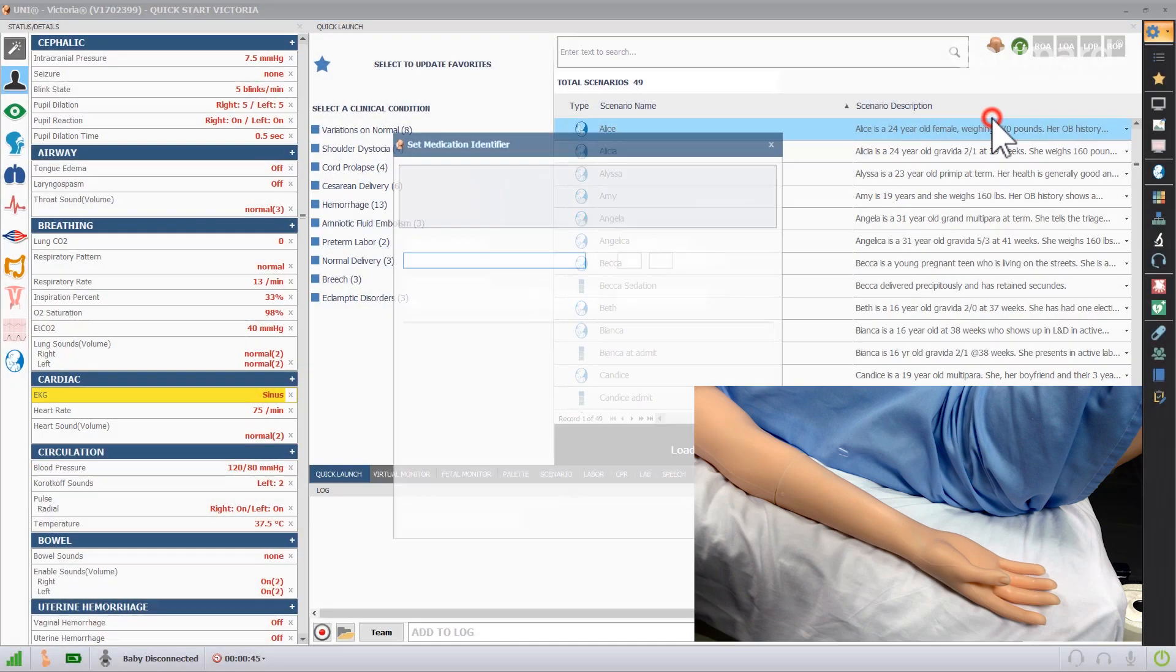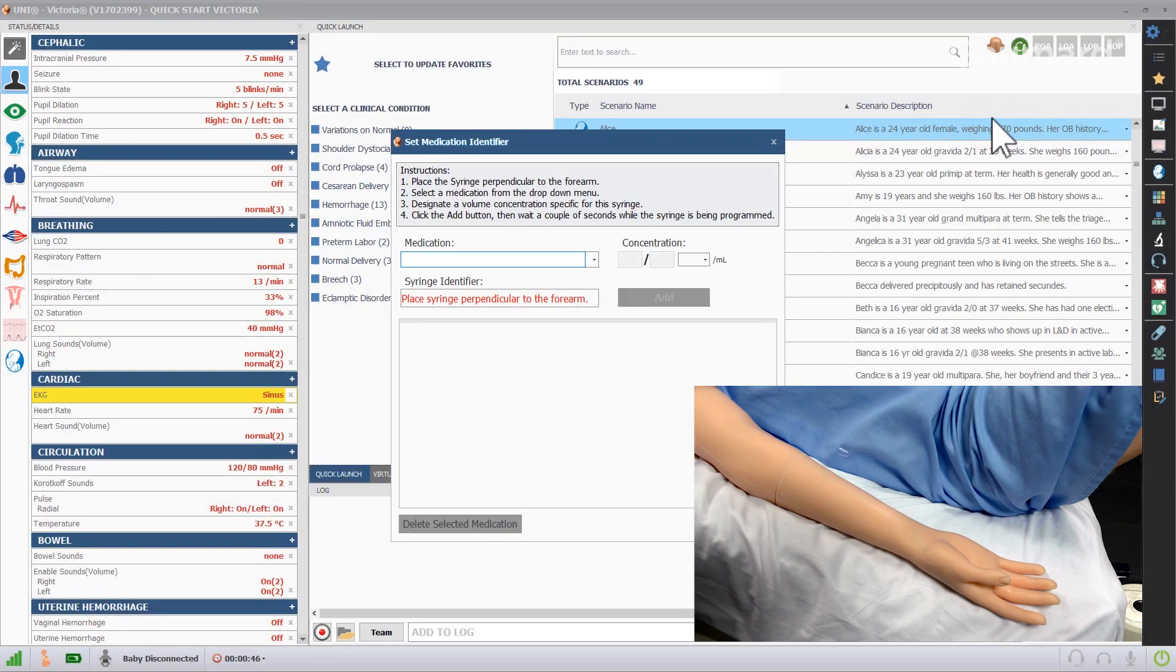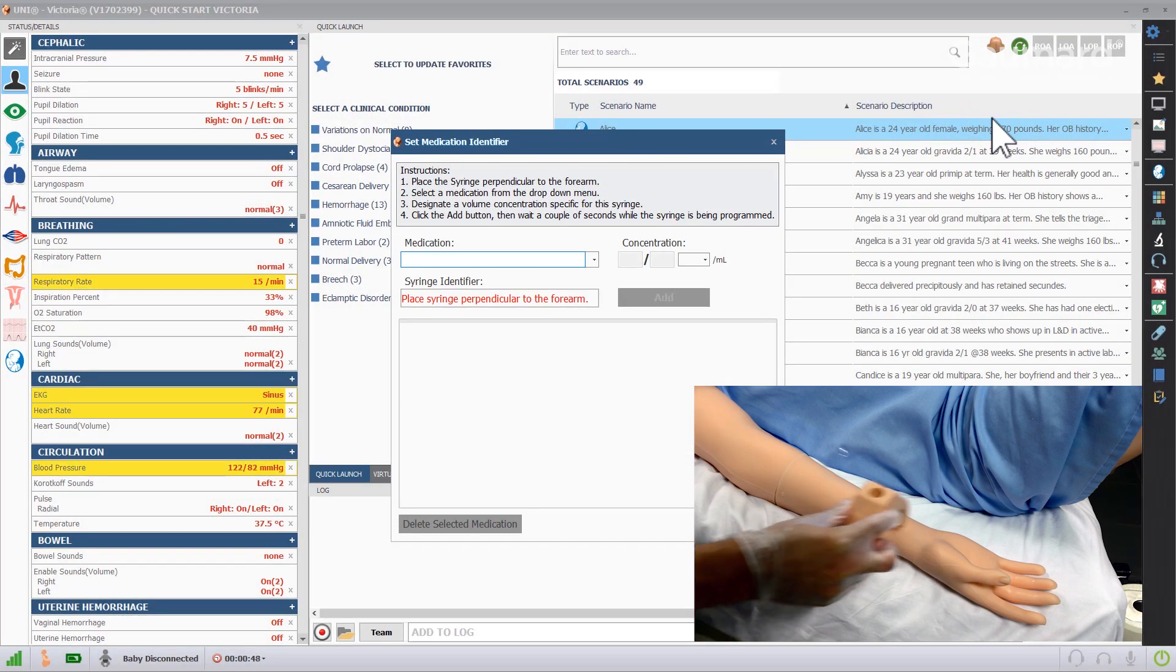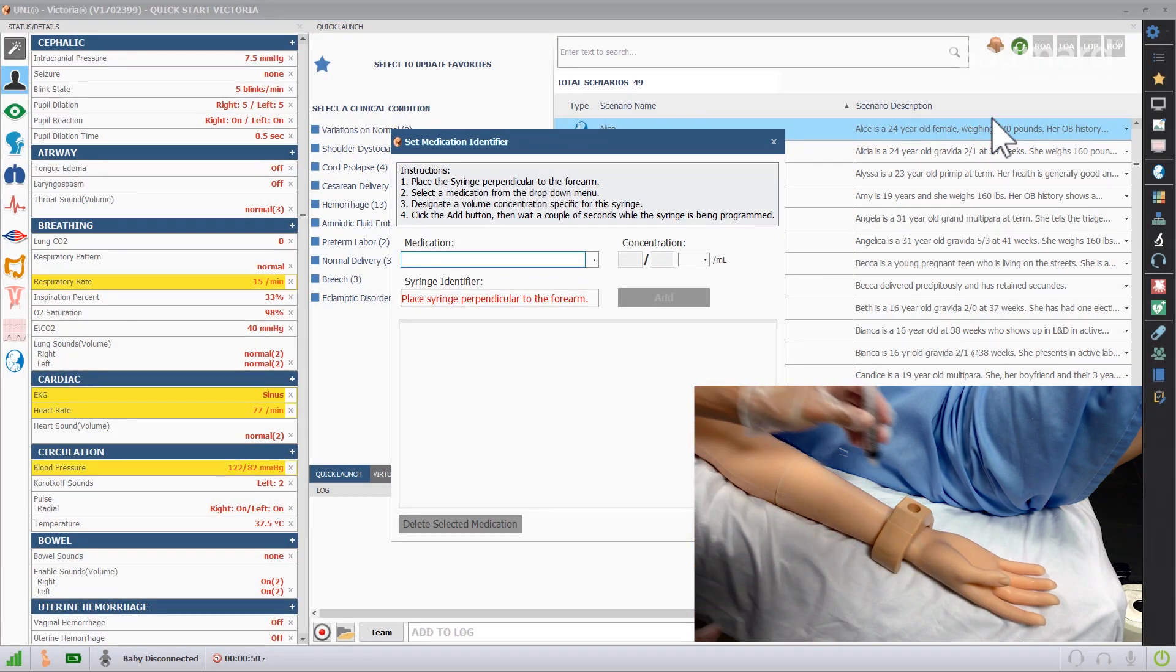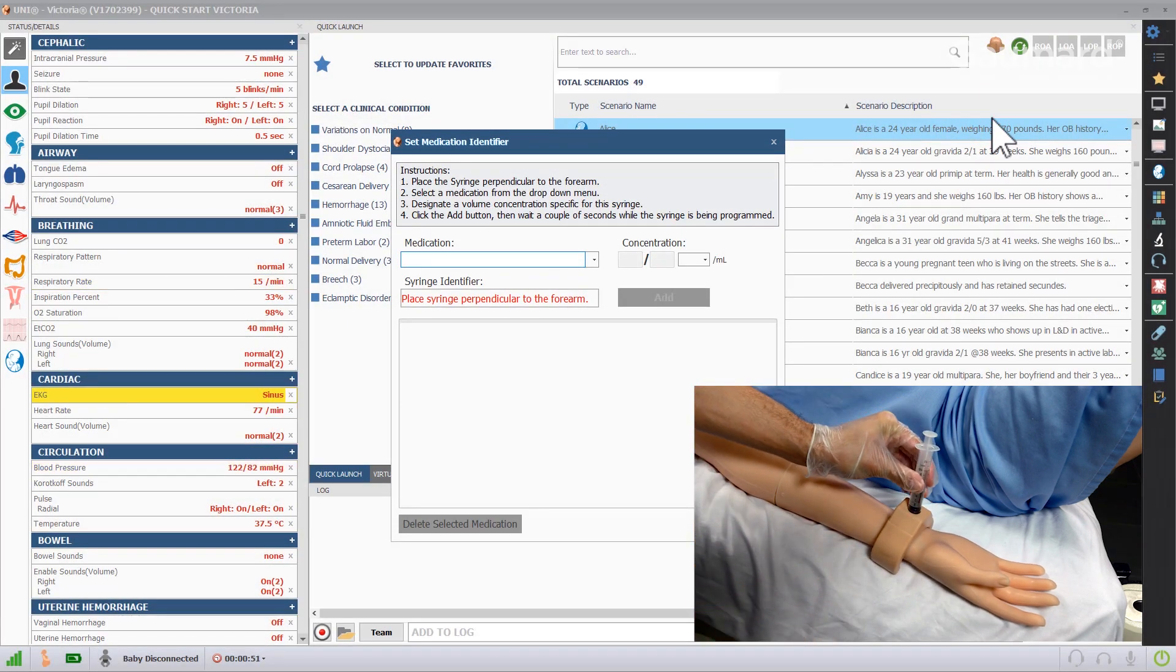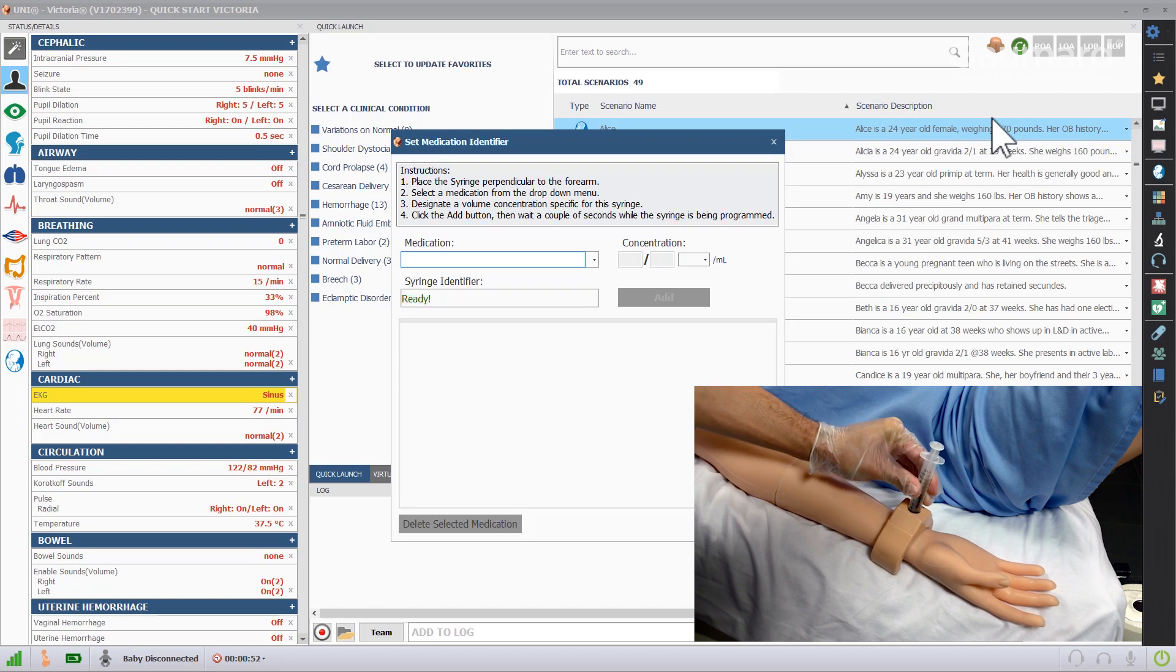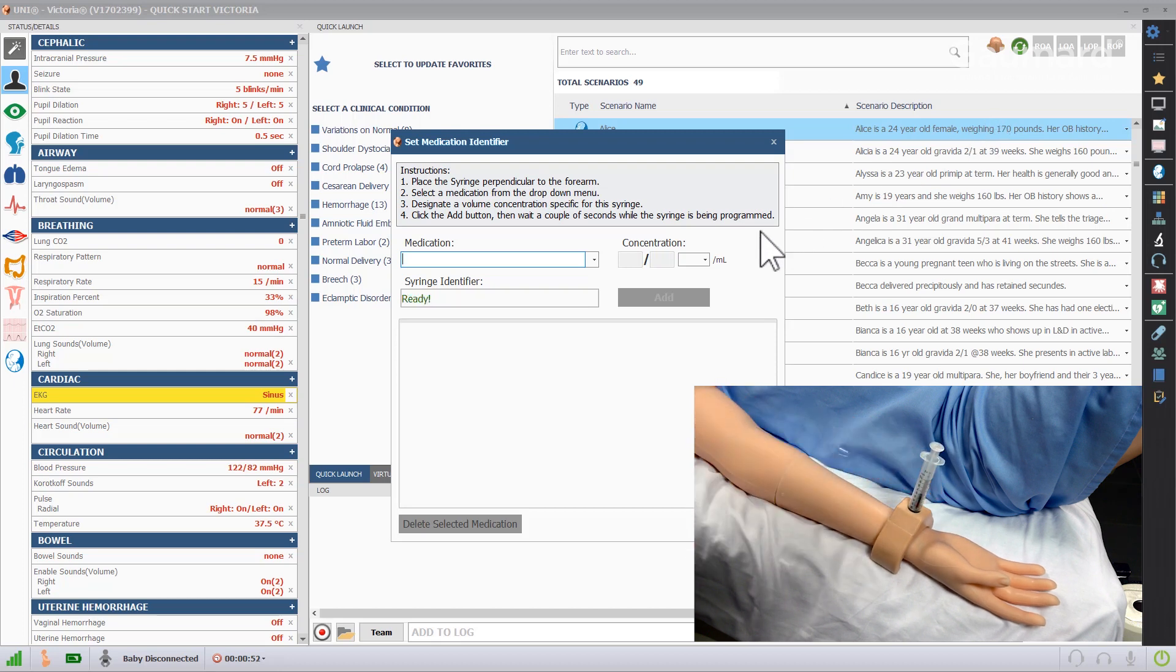Rotate the lower arm so the palm of the hand is facing up and attach the syringe holder to the wrist. Insert a tagged syringe into the holder.